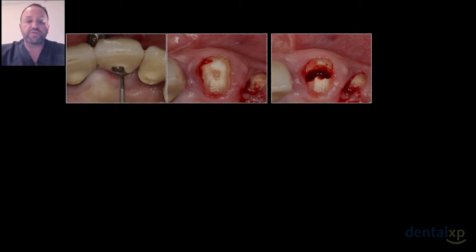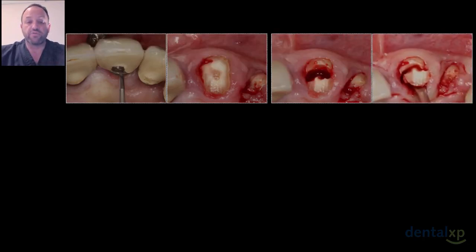So what I prefer to use is a comet drill, and if anyone wants to know what the numbers are, I'll tell you about them. These are long-shanked root resection burrs on a fast turbine handpiece, which allow you to cut effortlessly through the root with very little vibration and very little damage to the bone or the tooth, and allow for a much easier removal.